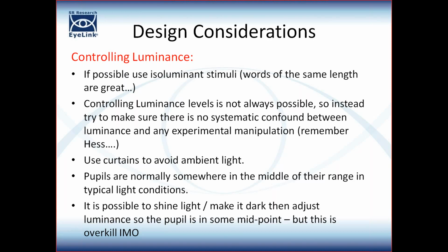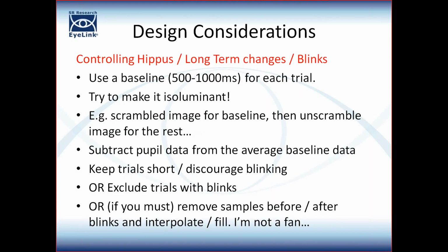If they're already dilated as far as they can because it's dark, you're not going to see anything. Similarly, if there's a really bright light source and the pupils are constricted, it may limit the amount to which they are prepared to dilate due to cognitive influences. So normal natural light is perfectly fine in my opinion.